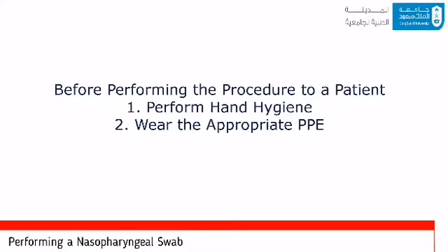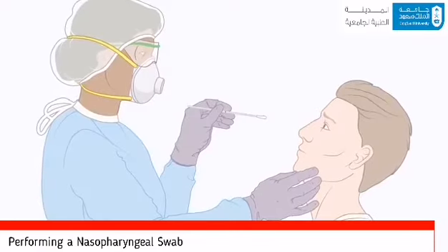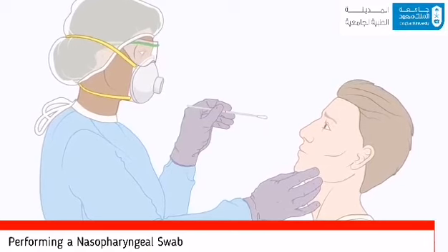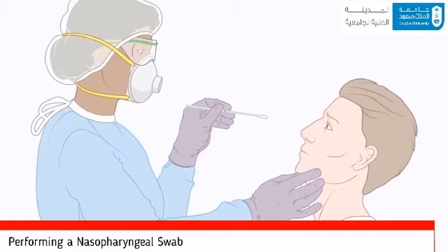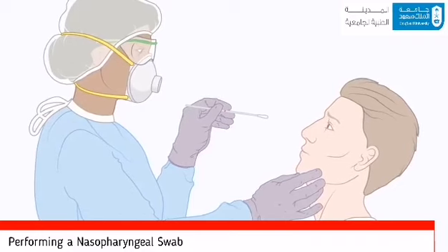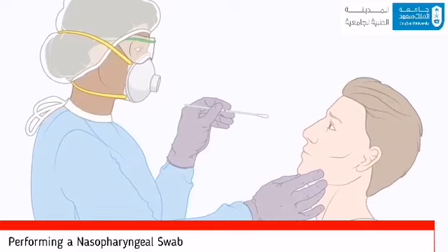Remember to perform hand hygiene and properly don your PPEs. Begin with carefully explaining the procedure to the patient. The patient should be alert and cooperative. Allow them to first blow their nose. The patient should sit and relax in a comfortable position during the sample collection process.